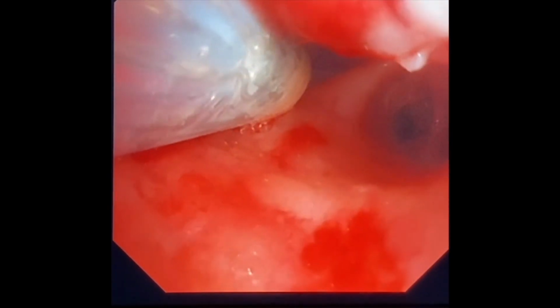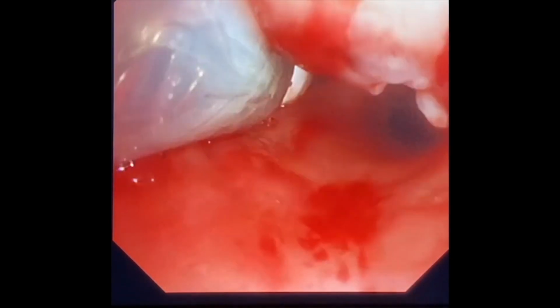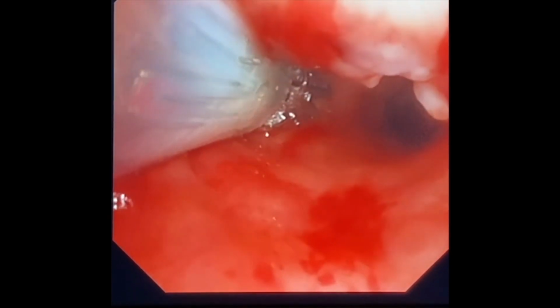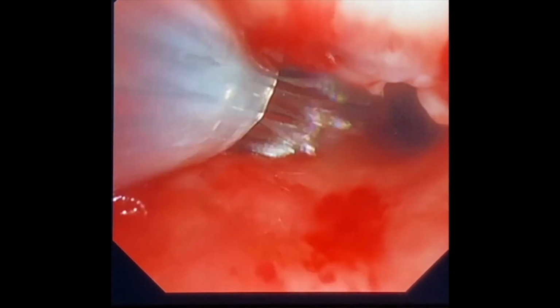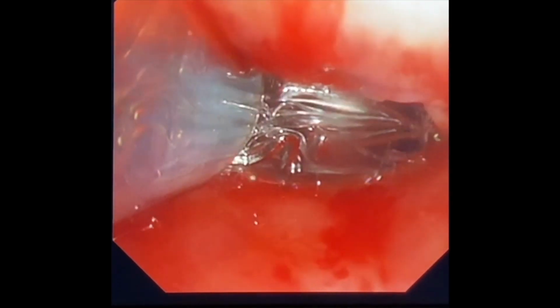The distal end of the stent is placed in the distal left main bronchus. The sheath is withdrawn, and this allows the stent to open up.